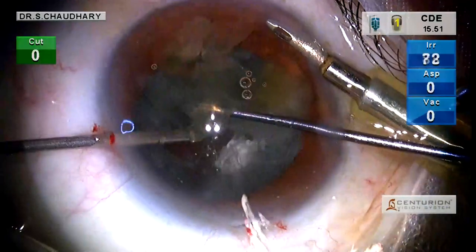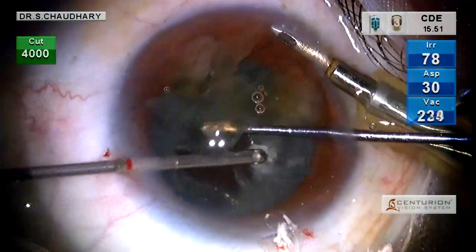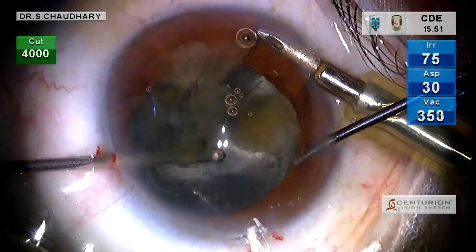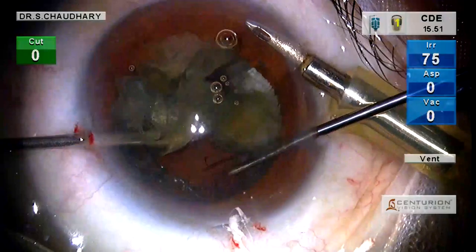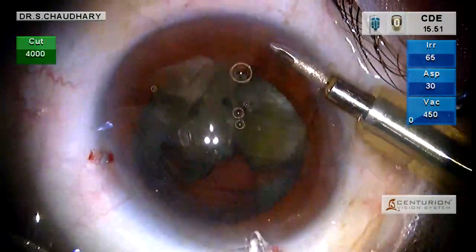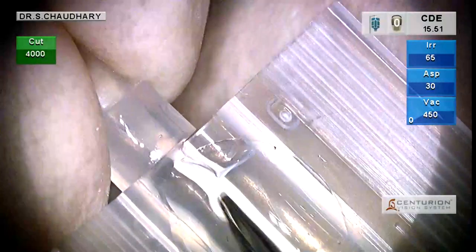Once a basic cleanup is done, one can evaluate what should be the next step. Because we have quite a few nuclear pieces here, we decide to use a bandage contact lens as a scaffold.